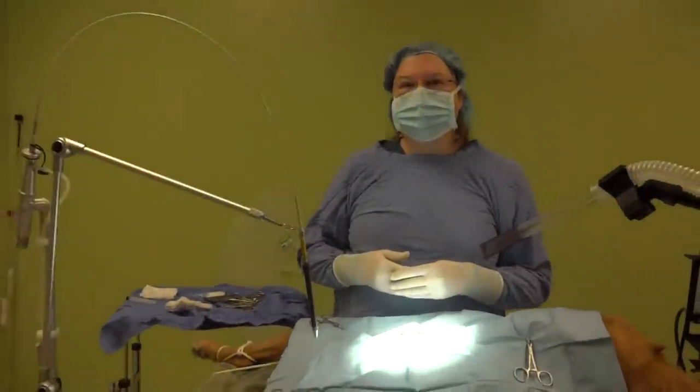We will ligate her ovarian artery and vein, and then the uterine artery and vein, and then remove those tissues.